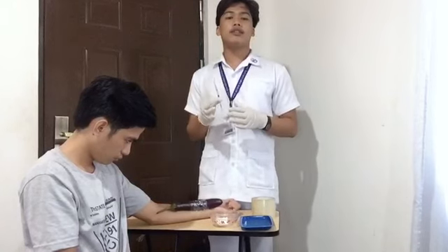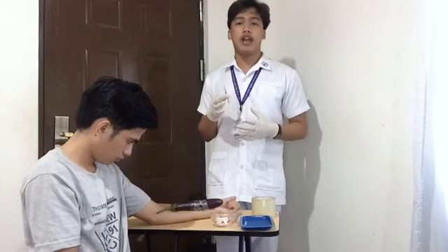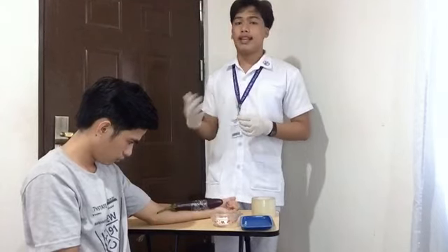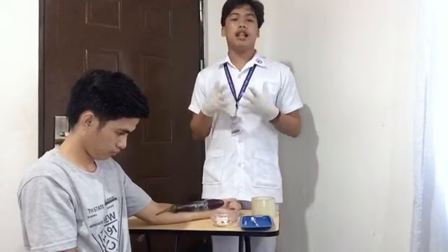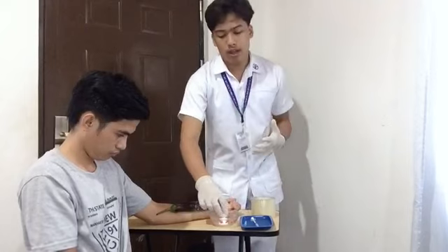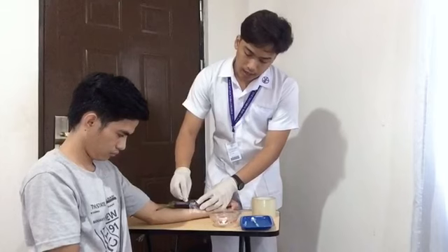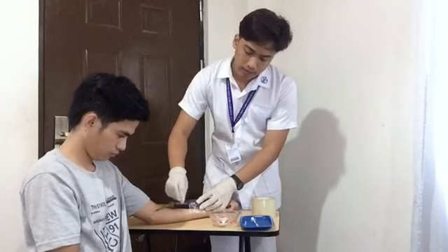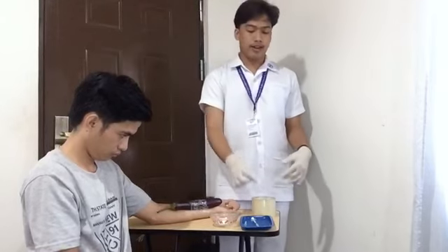Next is avoid using sites that are tender, inflamed or swollen, or have lesions, to avoid any further complication to my client. Next is apply clean gloves as indicated by agency policy, and cleanse the skin at the site using a firm circular motion. So I am going to put these cotton balls on the skin in a circular motion. Okay, I'm going to discard this.